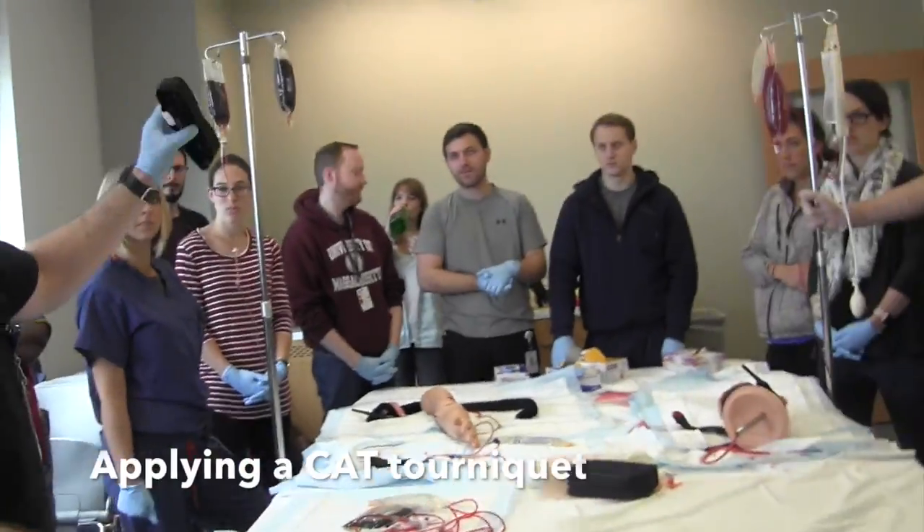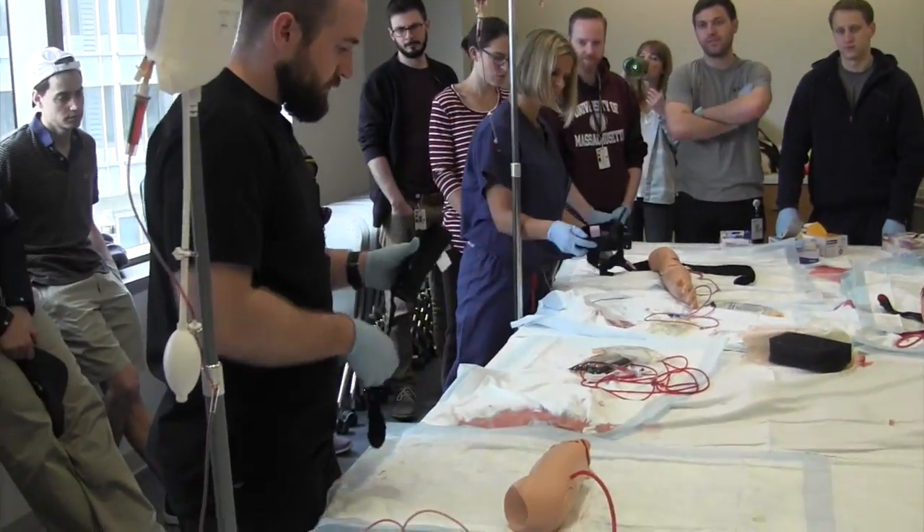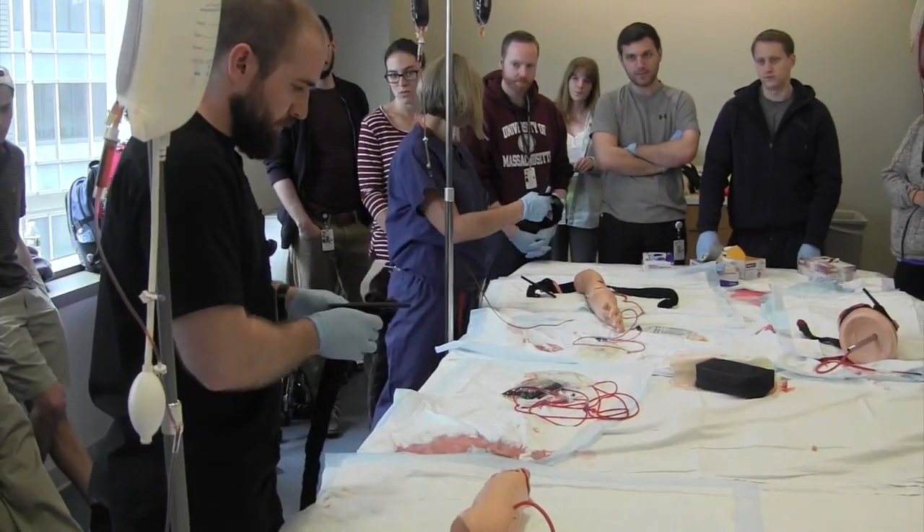The tourniquet — how they'll come to you is packaged essentially like this, and you have to unwrap it. The way that these work is that ideally they can be done one-handed, but when you're using them on another person, you want to use both arms.